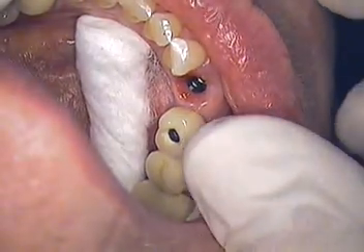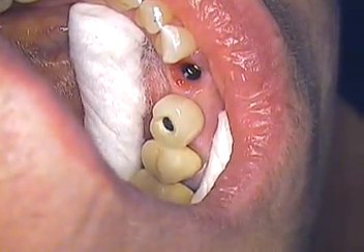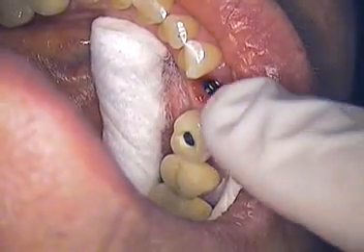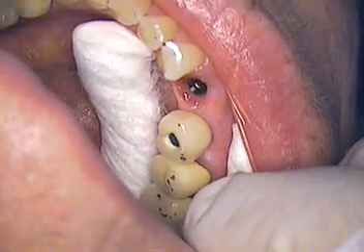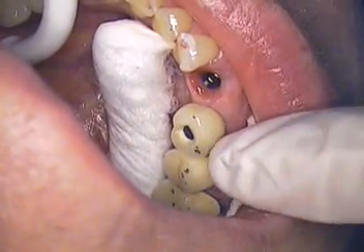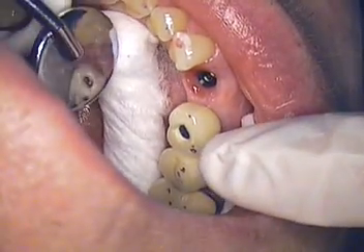How does that feel — tight at all or comfortable? I notice there's no blanching around in the tissues. With the paper, close all the way down and tap your teeth together. How did that feel to your bite? So she's hitting off mesially and distally. We will give her a good centric holding contact in the composite.